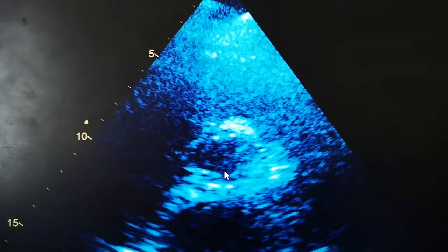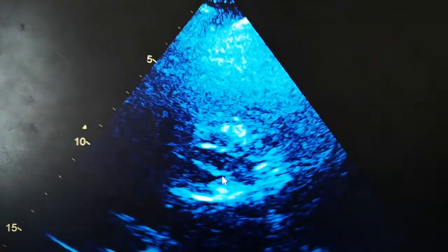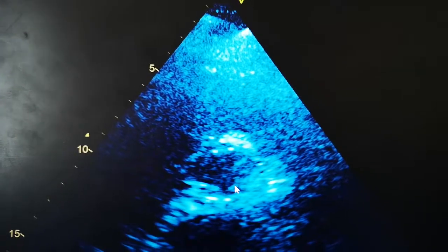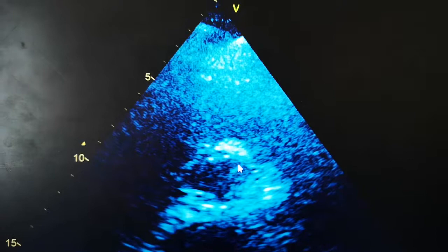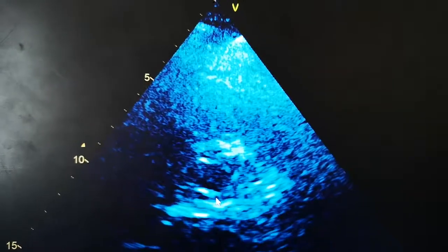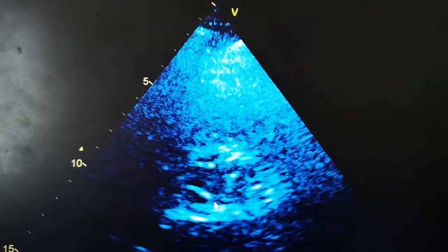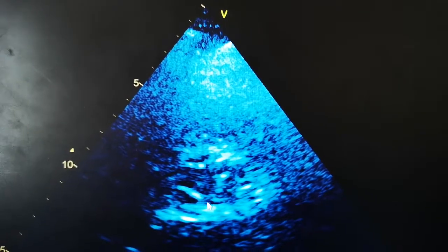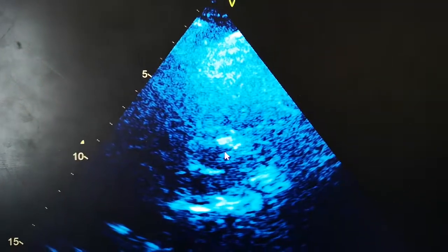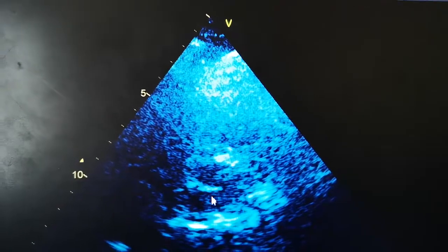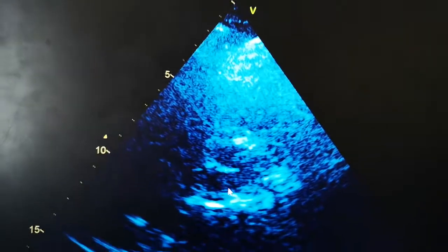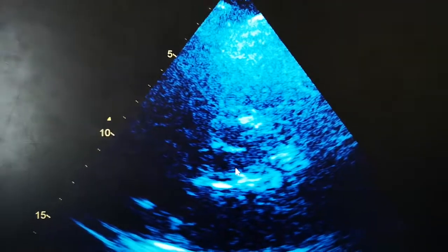Going slowly in peak systole, you can still see one, two and three cusps clearly. And then in closure you can see the Mercedes-Benz pattern form. This is how a normal aortic valve looks.